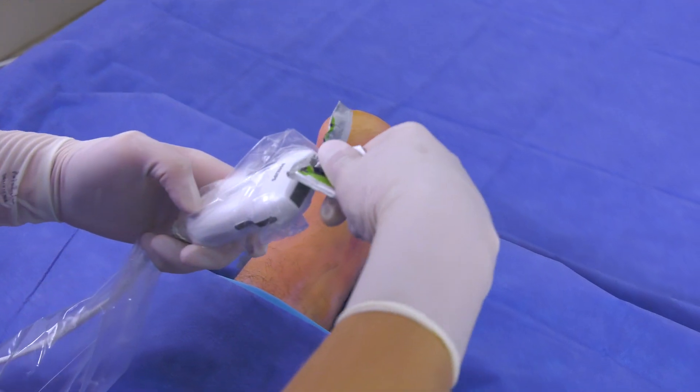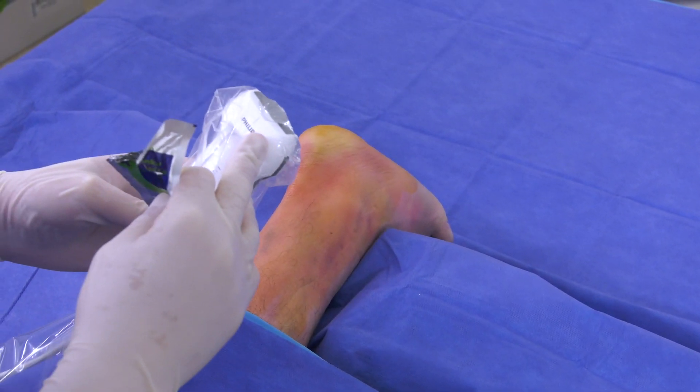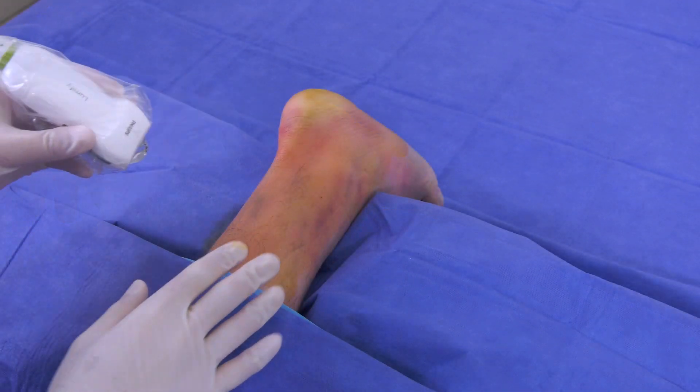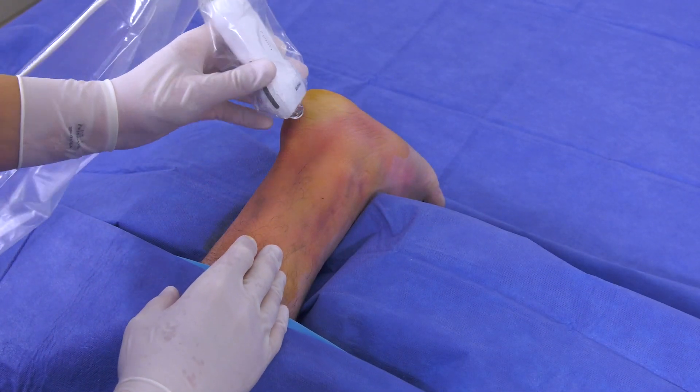The procedure is performed under ultrasound guidance to visualize both the pathologic tissue as well as the positioning of the TenJet device. A layer of ultrasound gel is applied to the probe below as well as on top of the cover to increase the transmission of sound waves and improve visibility.